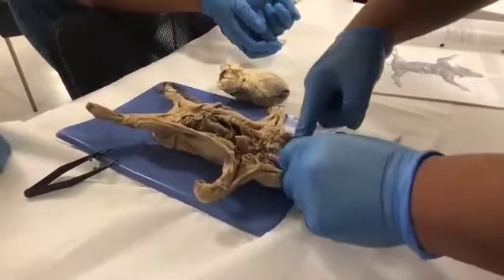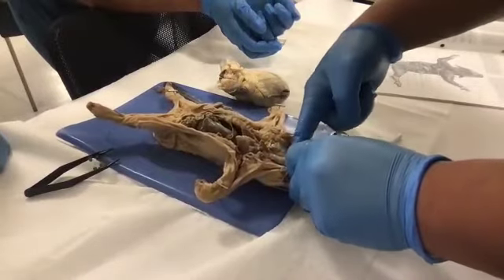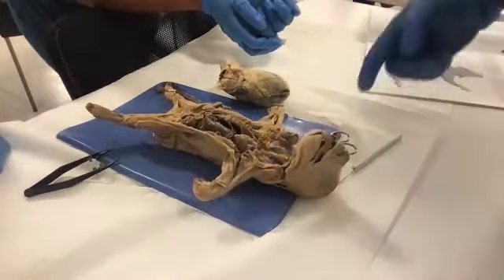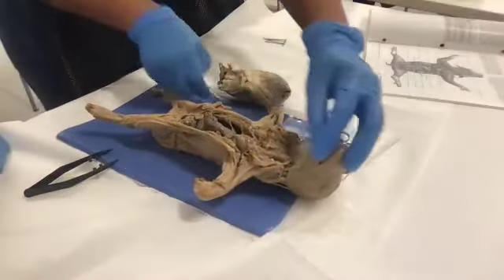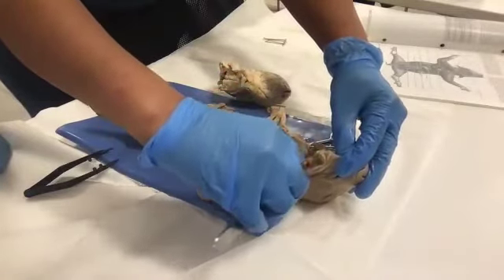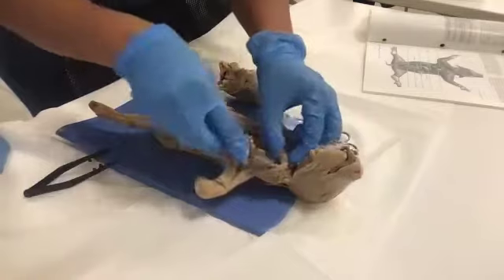Okay, so since you're still up, I want you to remove from here to here, upcut and remove all of this out, and then we can all inspect it. And then we can look at the upper respiratory tract to the lower respiratory tract and why it is so important to us.